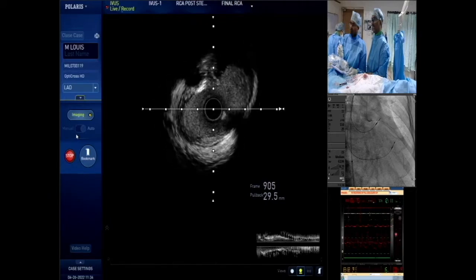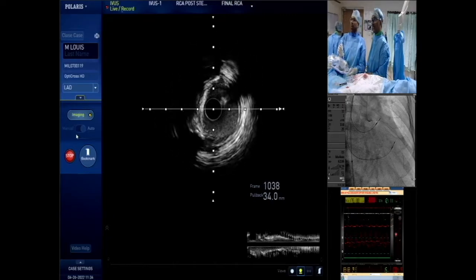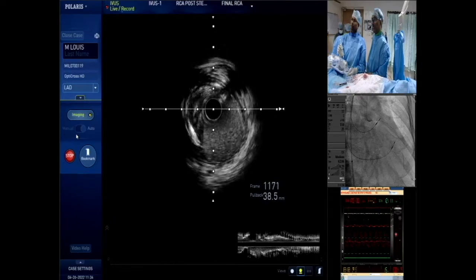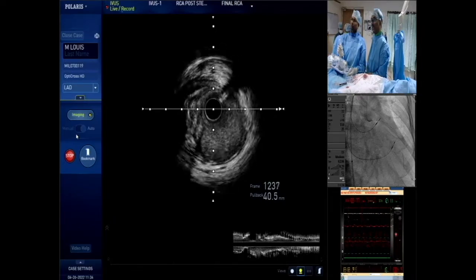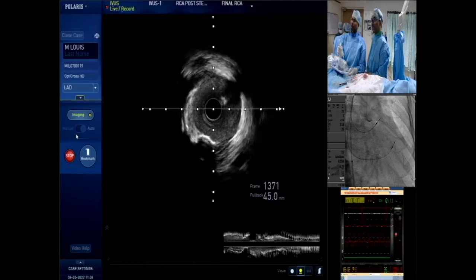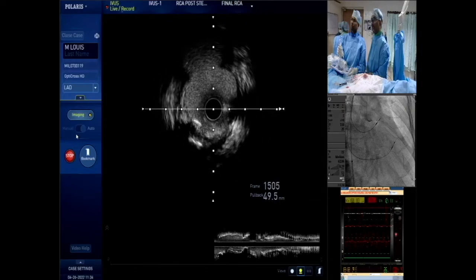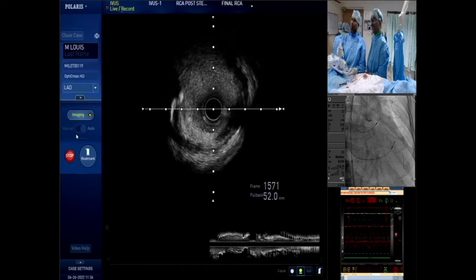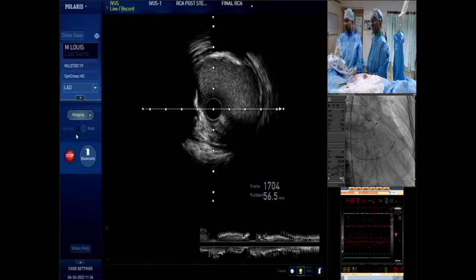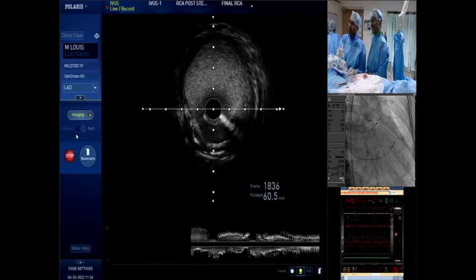Yeah, this is a septal. We have not caused any damage around it. This is a plaque proximal to the septal which we crossed. We have not dissected the vessel. Yeah, we are almost coming to the ostium. Yes, this is LCX, Ramus and LCX. So this is LMCA. There is some plaque, but there are no dissections. There is no damage caused.